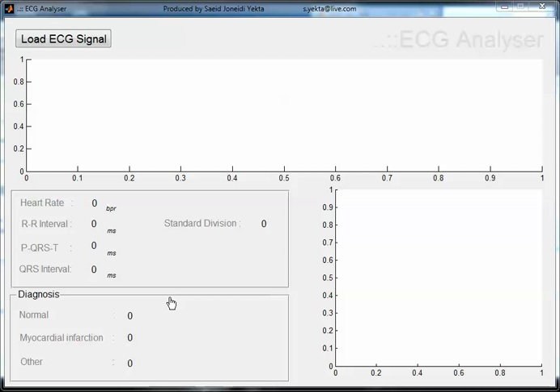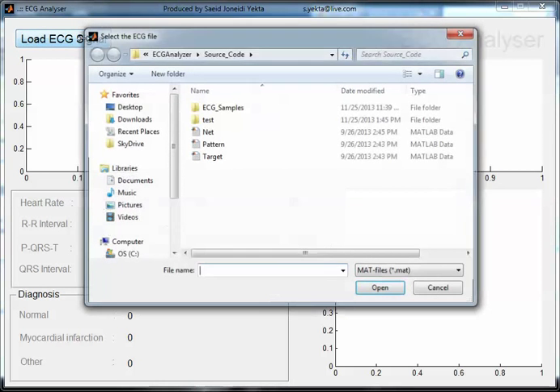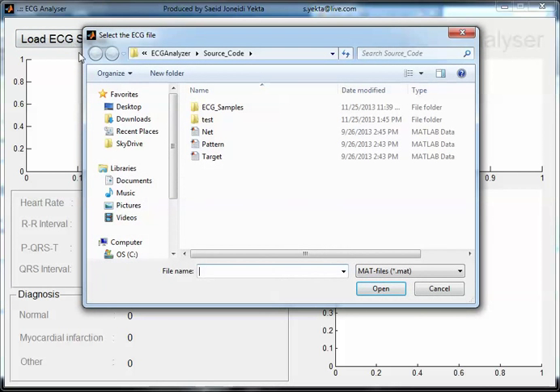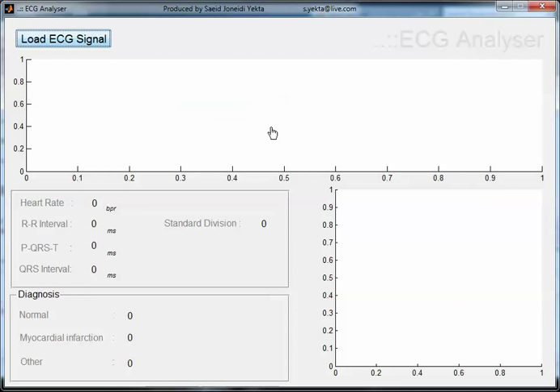Welcome everyone. In this video I want to show you an automatic ECG analyzer which is totally implemented by MATLAB. As you can see here, this user interface is very simple to work with. To use this system, just click on this button and load an ECG signal. After that, the system automatically starts to process and finally generates a report to the user.